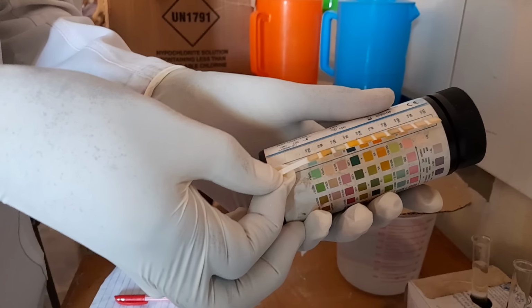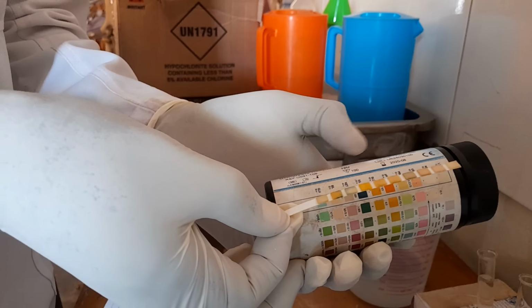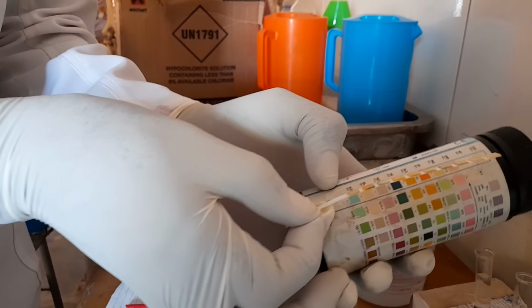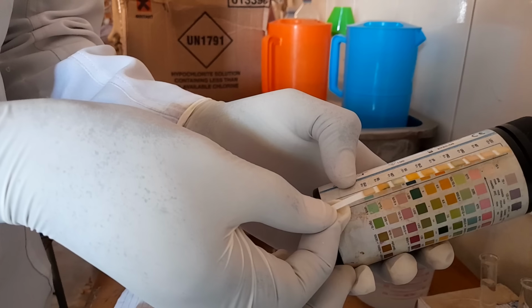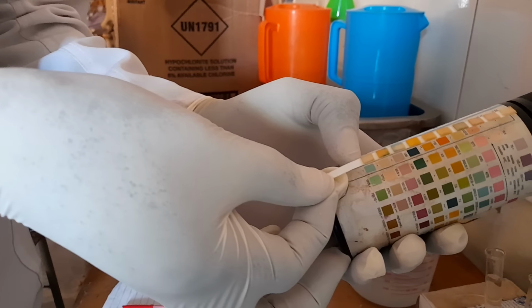You start timing, so as soon as it is 30 seconds, then you start reading. So we'll just assume it's now 30 seconds. So we'll go to glucose. You compare with glucose here. So what you do is you just check the color. Has it changed the color?